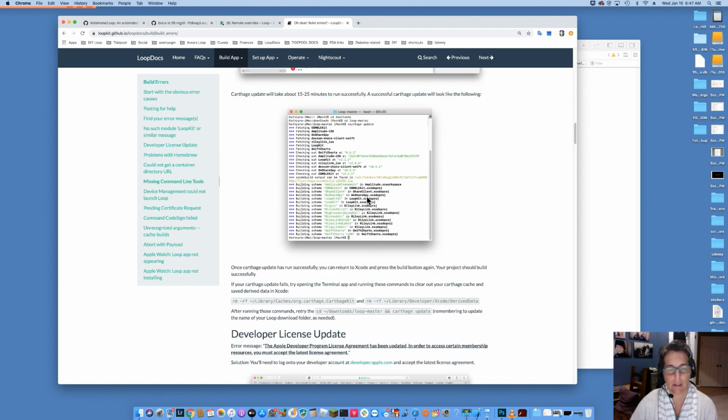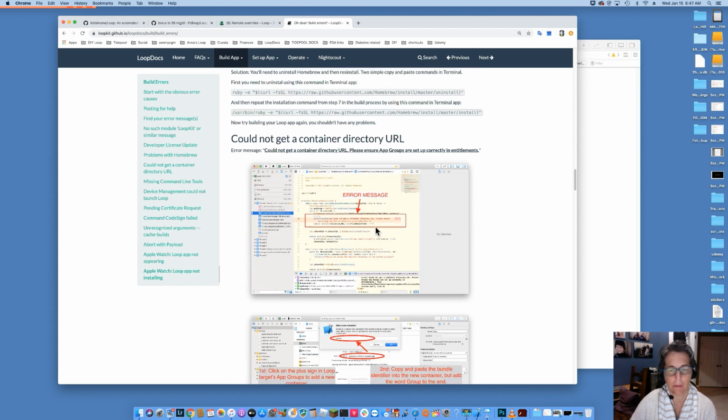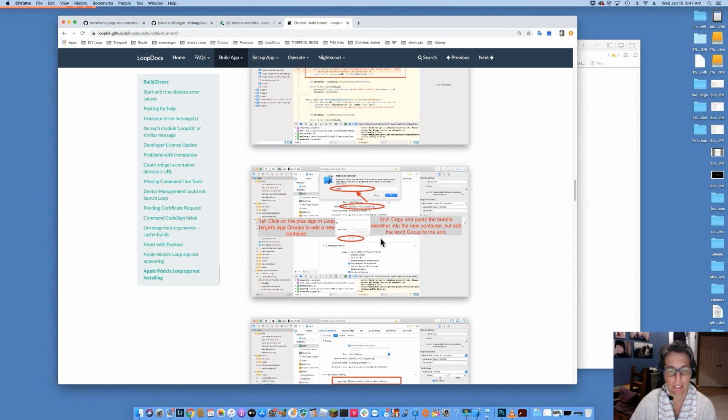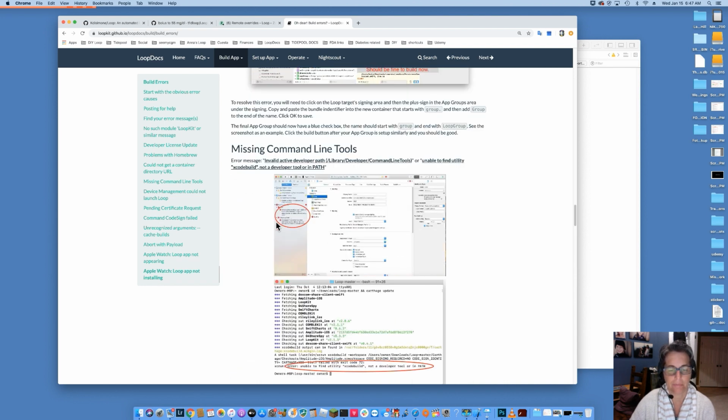So there's an error message there. Problems with Homebrew look like this. See if your report navigator contains a text that looks like this, where it talks about another Git process and Homebrew's having problems, or maybe there's an error message like this. So basically, scroll through and look at these error messages that are circled. Xcode, xcrun error: unable to find utility xcodebuild, not a developer tool in PATH.